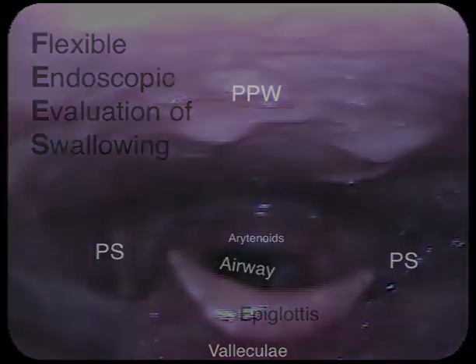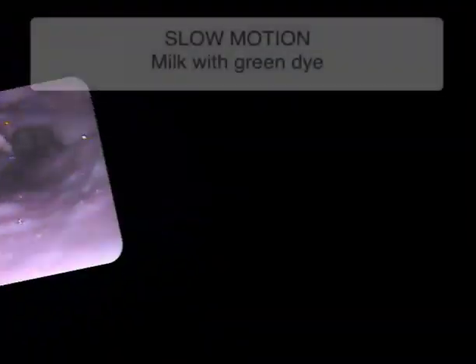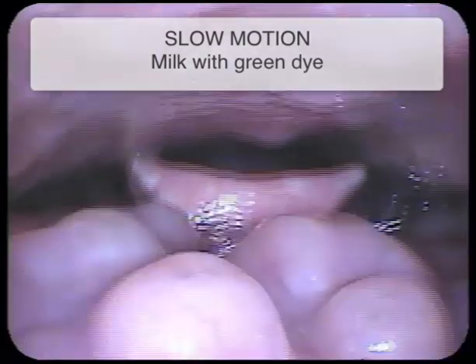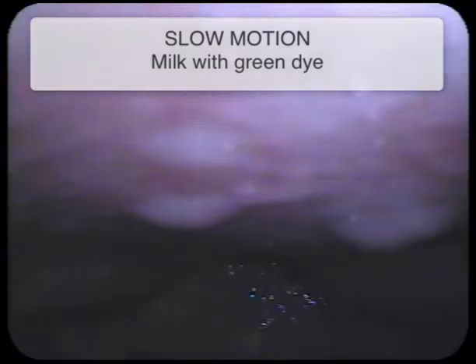Now let's look at some moving images. First we'll see some milk with green dye. Now let's watch that again in slow motion. You notice the white-out that occurs when a swallow happens.